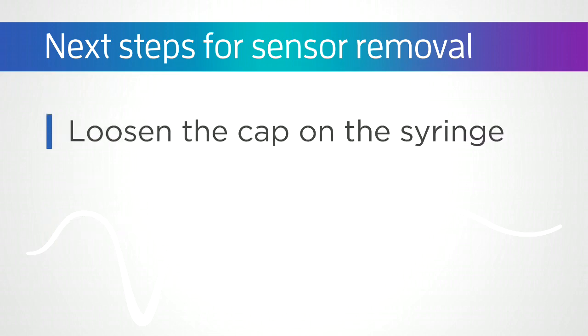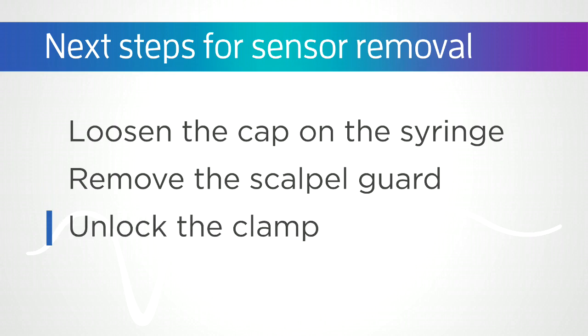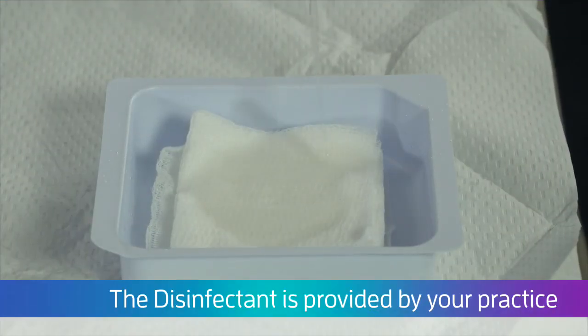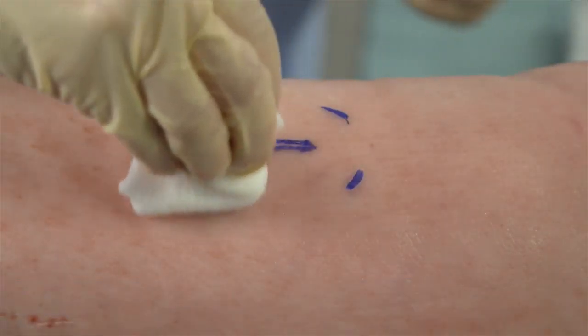Loosen the cap on the syringe. Remove the scalpel guard and unlock the clamp. Now you're ready to prepare the incision site. Using chlorhexidine or betadine, disinfect the site using sterile swabs or gauze. Apply at the planned incision line.